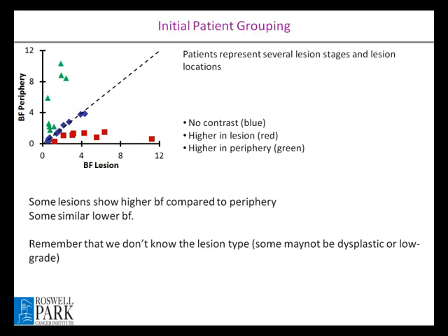Now, after, let's say, 25 patients, we wanted to look at the pre-treatment contrast. My aim is again to focus on changes, not the pre-treatment contrast, but I am showing you what we found. What we found is that some patients actually don't show contrast. And remember that these lesions are not really all cancer lesions. They are totally different sites, different lesions. It may be mild dysplasia, or some of them may be cancer, but some show high blood flow and some show low.